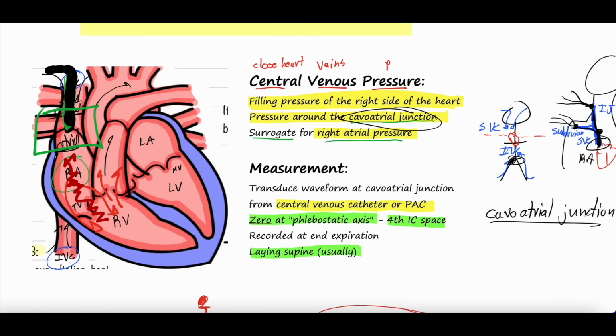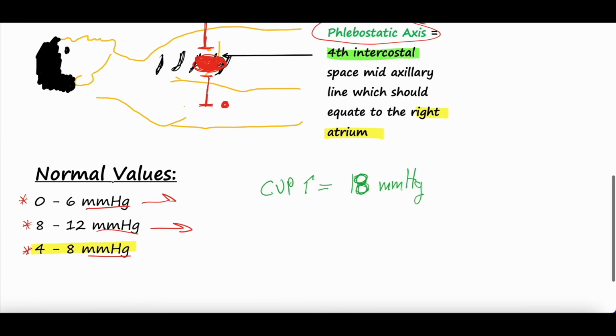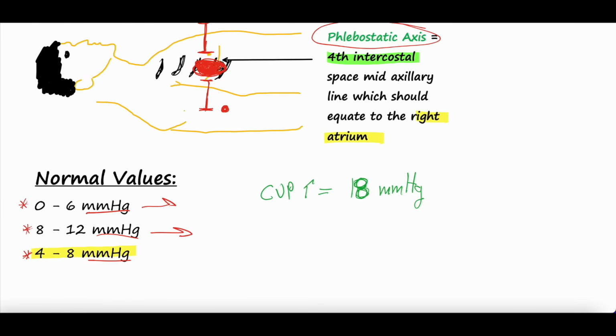Let's say you have a dilated right atrium that isn't able to squeeze that well. That'll cause your CVP to be higher, because the right atrium can't squeeze all that blood out as robustly as someone else's. So there are different things that affect the CVP, and we'll talk about them in future videos. But a lot of people traditionally use CVP measurements as an equivalent for volume status, and it's not perfect. It gives you an idea, but it's not perfect.